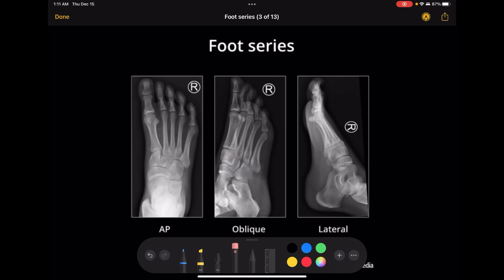The oblique also gives you a better view of the tuberosity of the fifth metatarsal. This tuberosity area is a place where there are a lot of fractures, and angling the foot a little bit gives you a different view to be able to see if it's fractured.